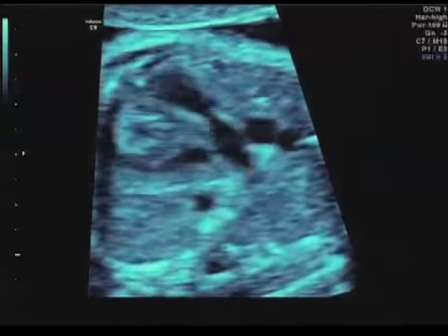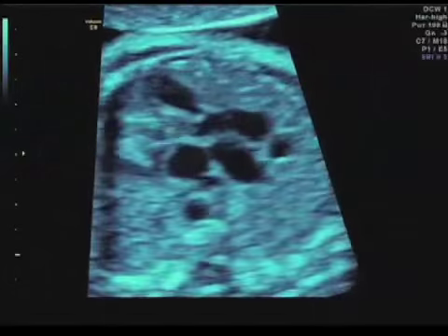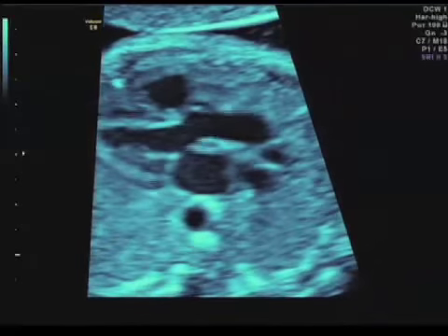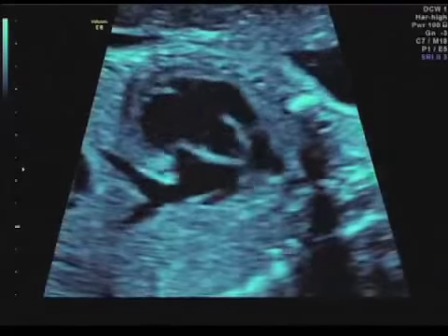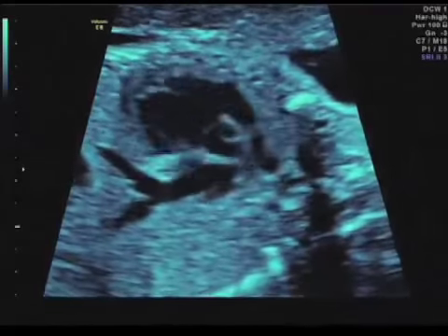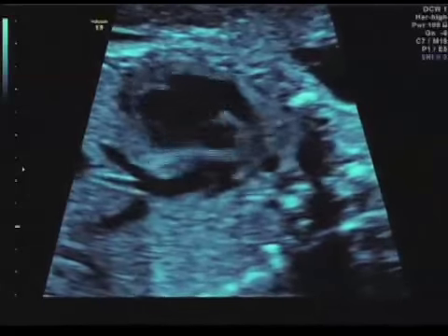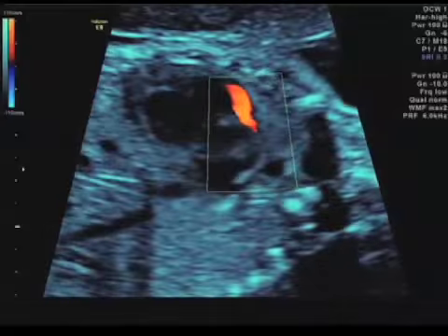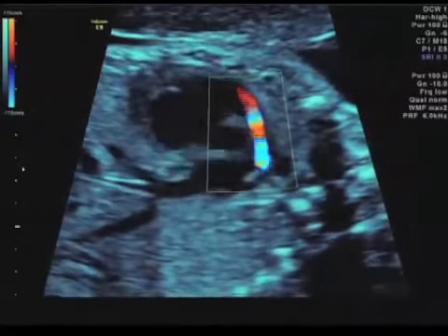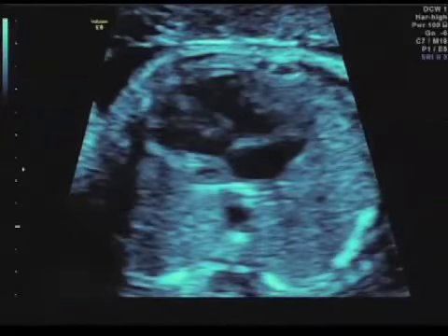You can see the pulmonary annulus relatively small, but you really see no true leaflets in that outflow tract, more like vestigial buds. When you put the color back on in the outflow tract of the right ventricle, you'll see just the two back and forth flow. Here we've cut the flow gain way down so that you can see it a little bit better.